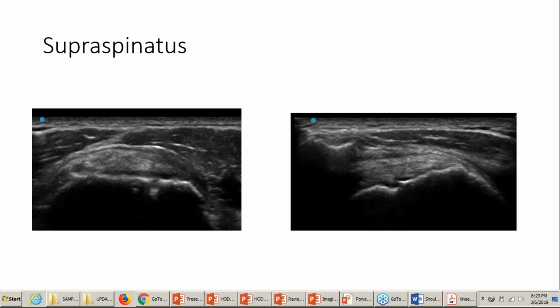So you will look at the fluid in the bursa, you will look at fluid in the sheath of the long head of biceps tendon. So the LHB tendon is a very important structure in the shoulder. It gives you indirect fluid signs. If you see more fluid, then there is something acute going on in this degenerative shoulder picture.